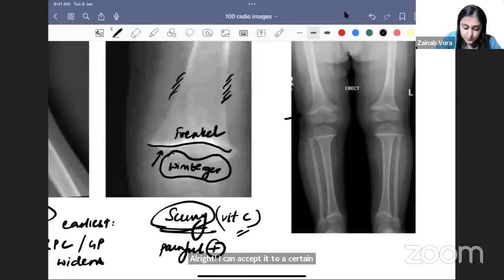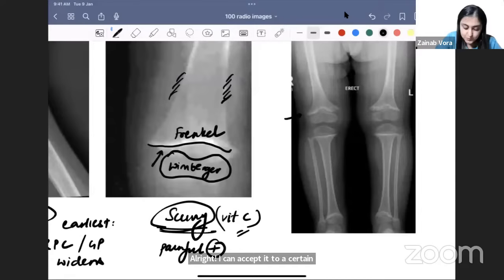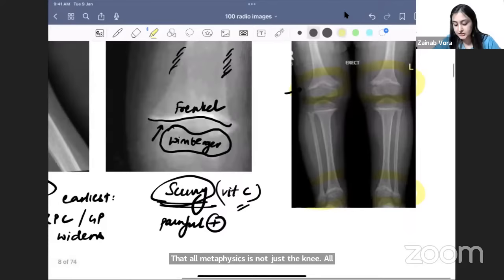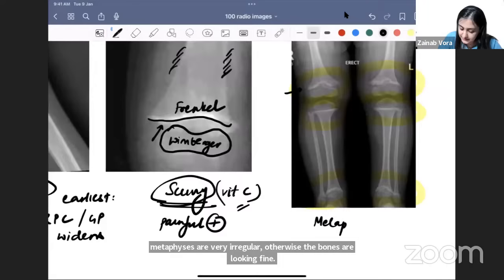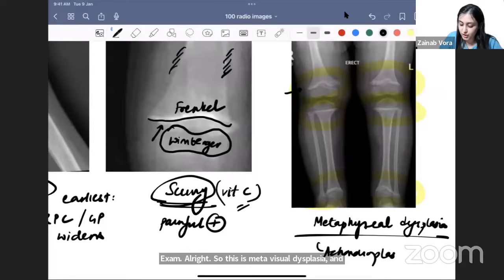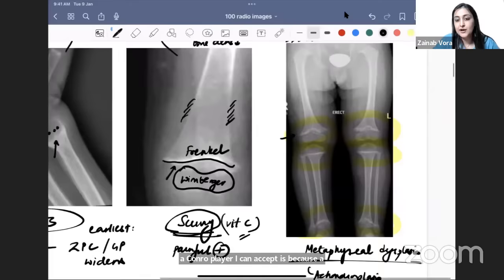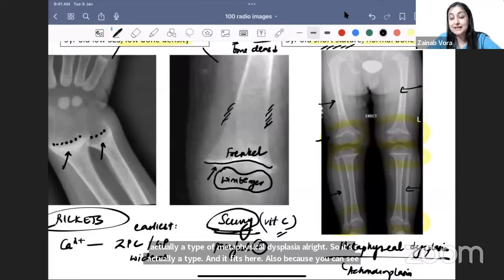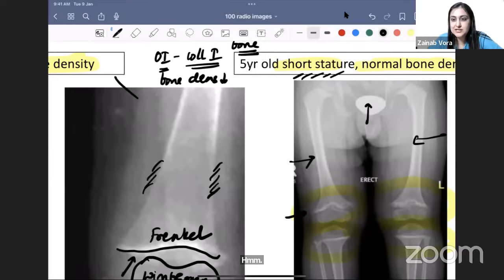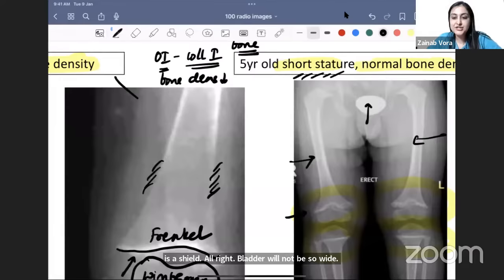Now showing an X-ray where all metaphyses — not just the knee — are very irregular, but the bones otherwise look fine. This is metaphyseal dysplasia, which came as one of the options in an INI ICT exam. Achondroplasia can be accepted here because achondroplasia is actually a type of metaphyseal dysplasia, and you can see the femur is almost equal to the tibia-fibula, indicating rhizomelic shortening.